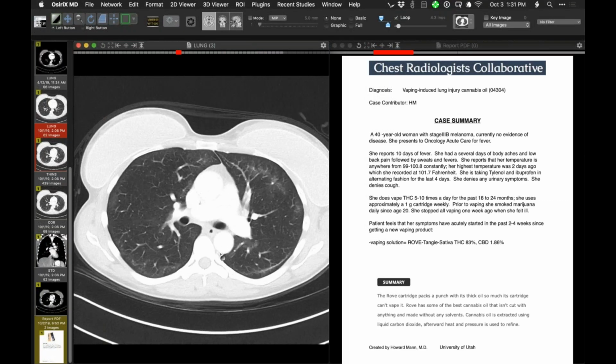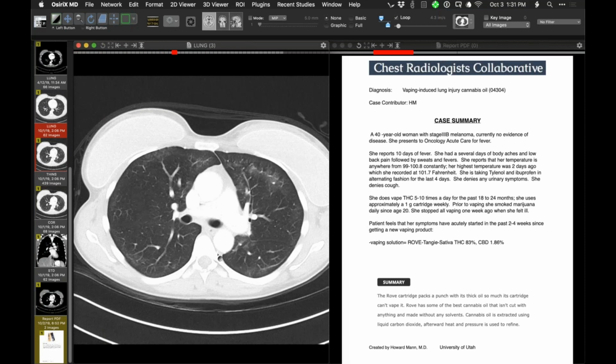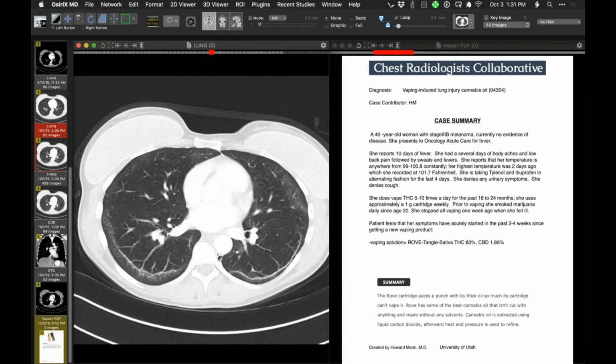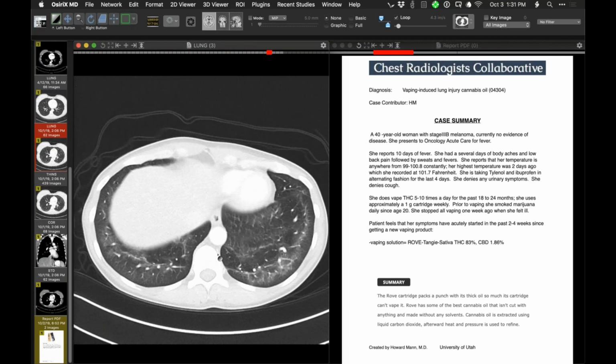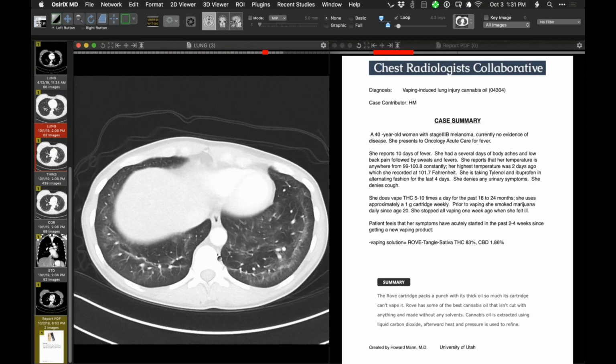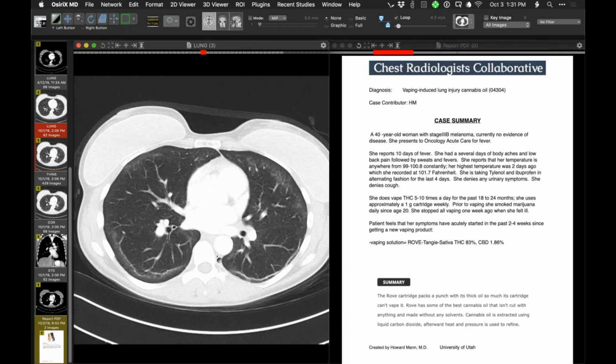So, third of 3, right? For this week already. Wow. So one from David, one from Peter, and a slightly unusual one from here, at least in terms of the context. But otherwise, the findings are very consistent with that. So it's out there, as David said.